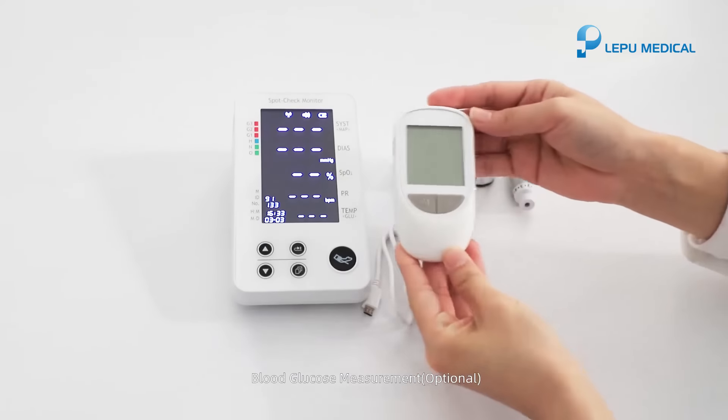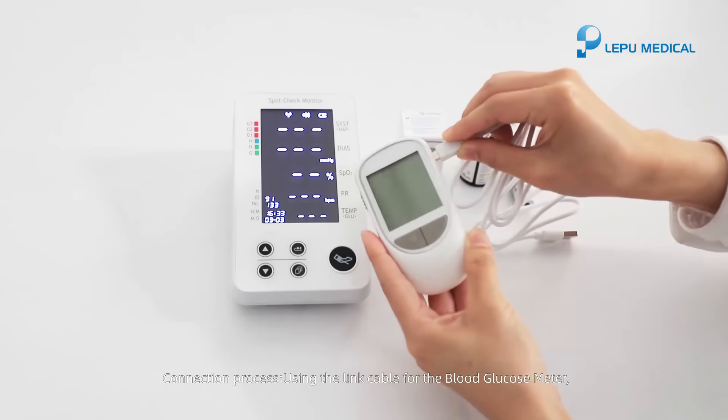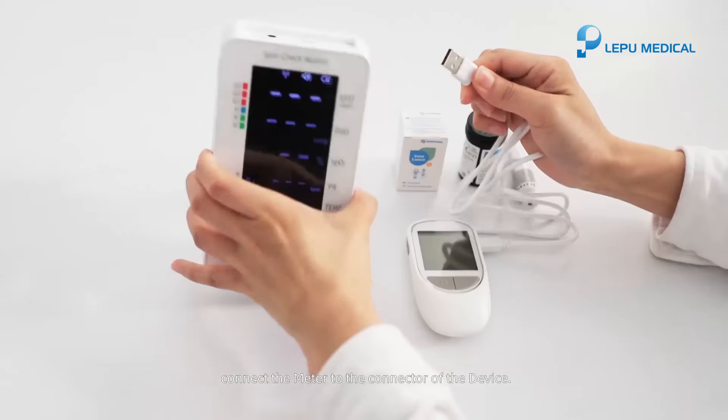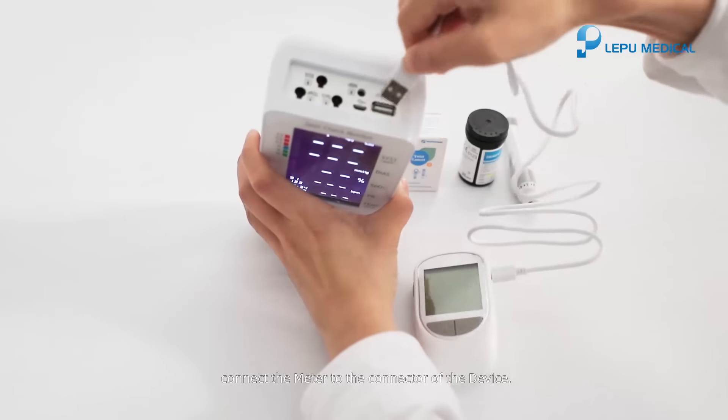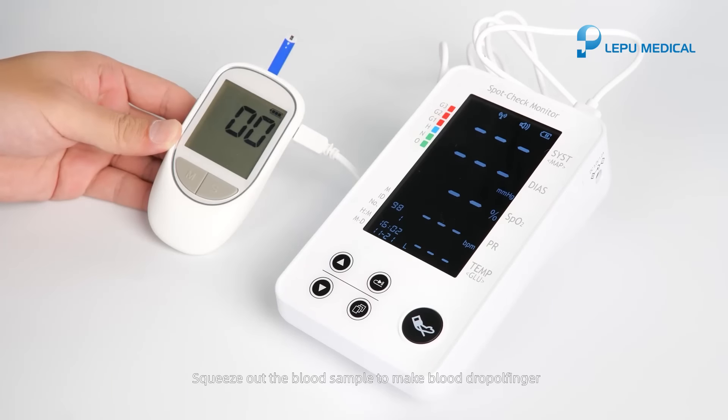Blood glucose measurement, optional. Connection process: using the link cable for the blood glucose meter. Connect the meter to the connector of the device. Squeeze out the blood sample to make blood drop on the finger.